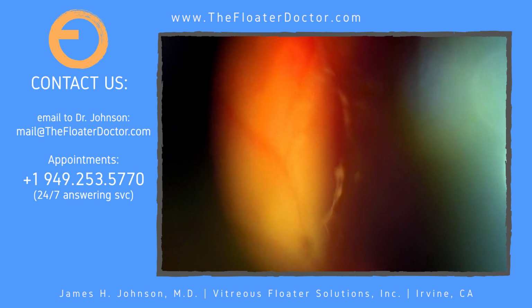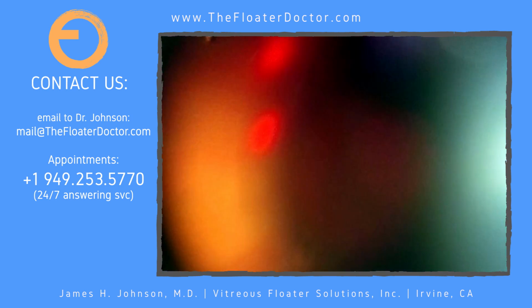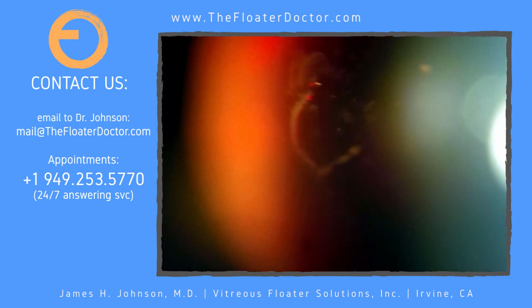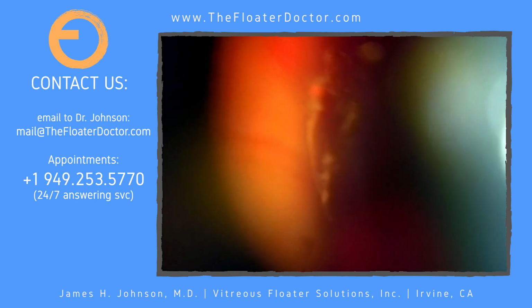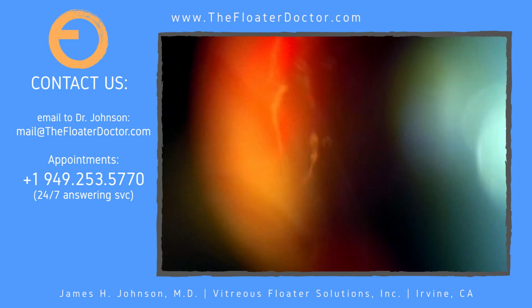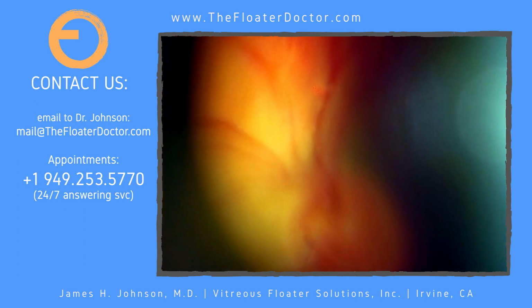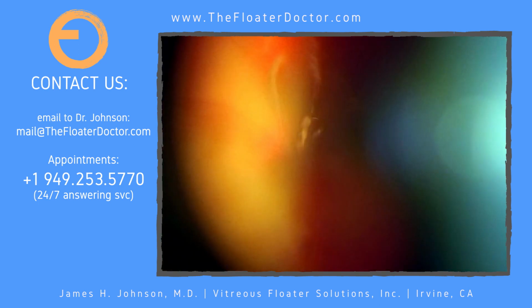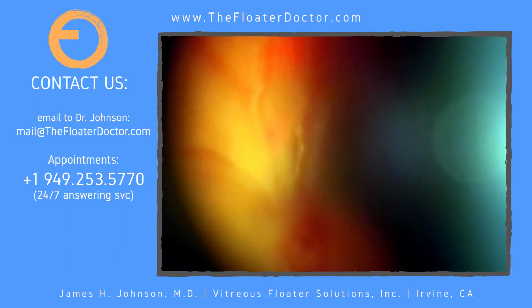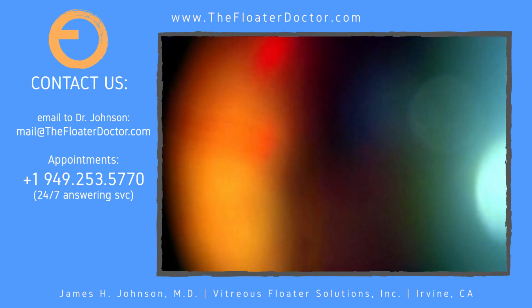It's behaving pretty well. Again, look down, and then back to the light again, and there it is. Okay, again, look down, back to light.